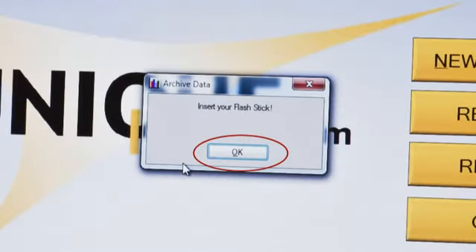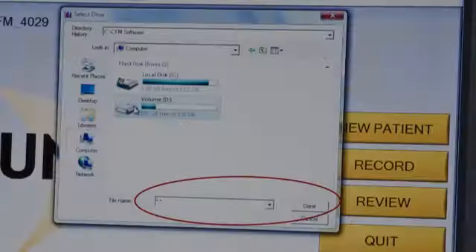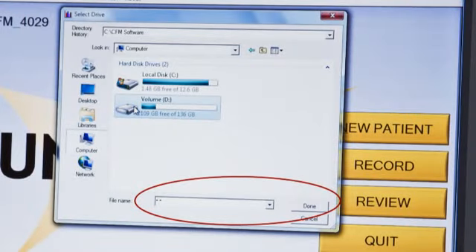A prompt will ask you to insert flash stick. Click OK. Select the drive location of the flash stick and click done.